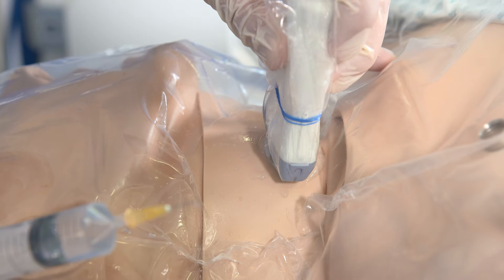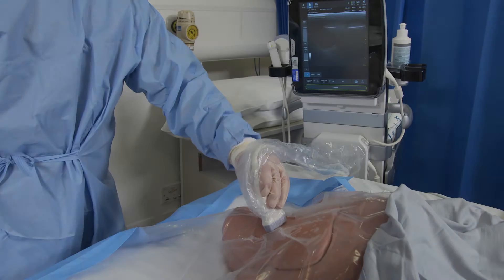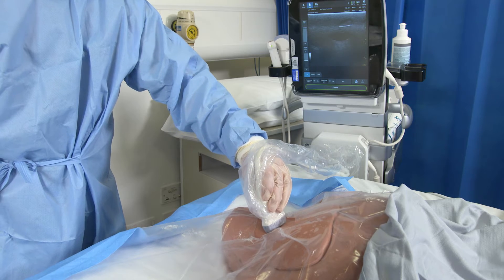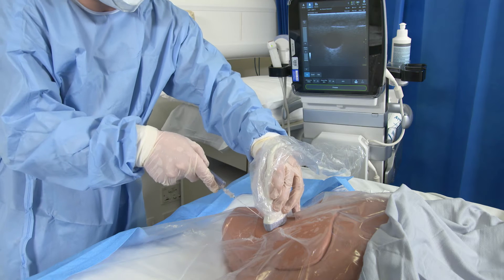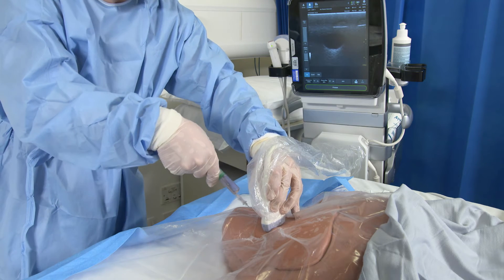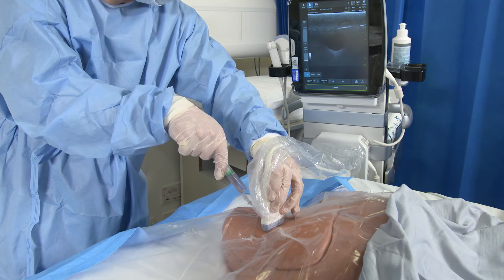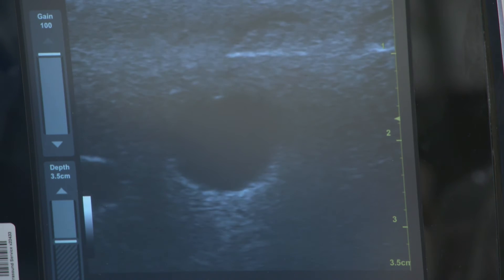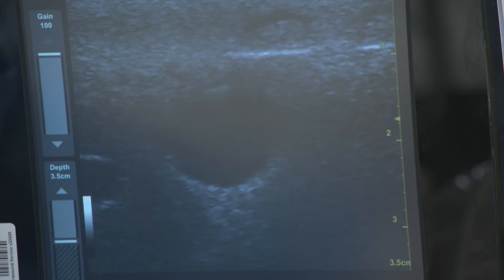In patients with a larger body habitus, you may need to use the green needle in the pack. Using the ultrasound probe, you can identify the relevant anatomy on the monitor. When you are happy, use the probe to guide your needle down into the vein. It's important whilst you're doing this to be withdrawing on the syringe the whole time. When you insert the needle, you should be able to see it down onto the top of the vessel — you can just see it bouncing on top of the vessel.